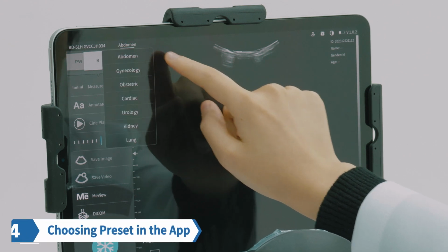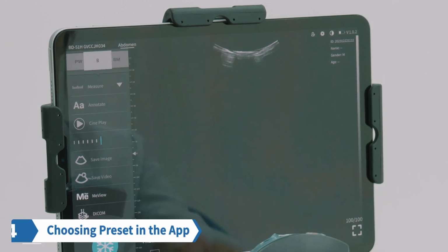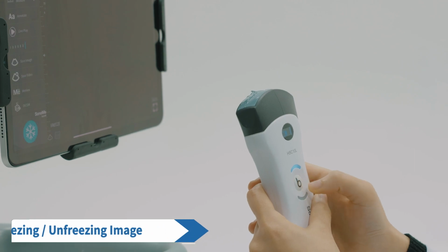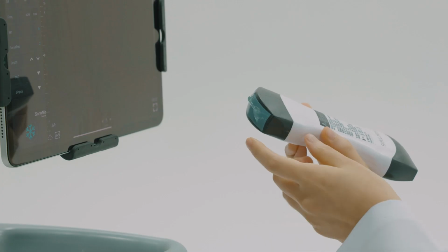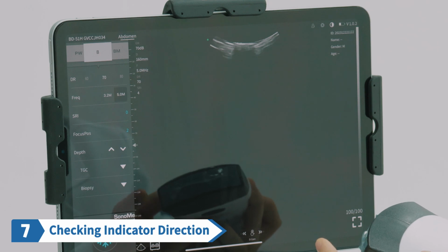4. In the SonoMe app, choose Abdomen. Under the preset section, select the B mode from the modes. 5. During scanning, you can freeze and unfreeze by clicking the power button. 6. It is recommended to hold the probe with the power button facing downward. 7. Before beginning the actual scanning, confirm that the indicator direction is correct.